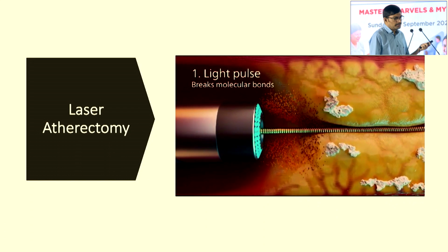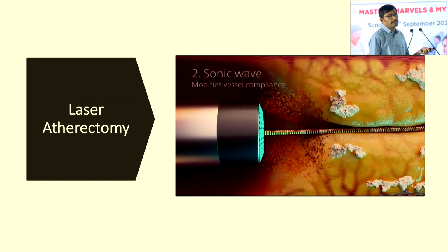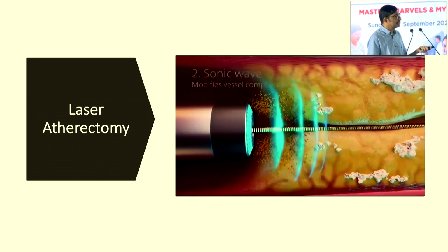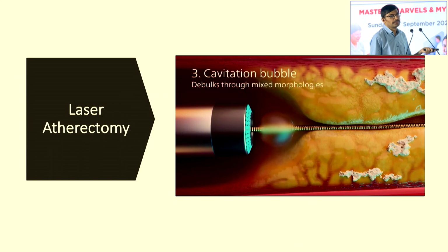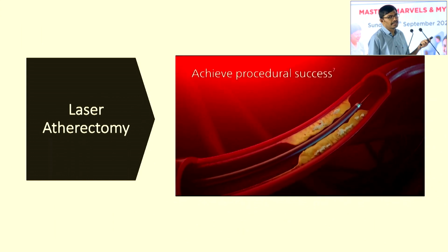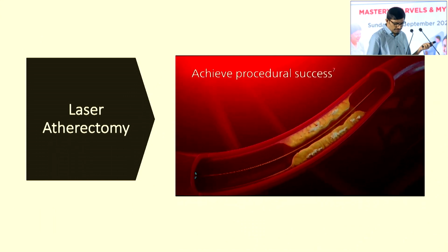So all these new technologies made our calcium treatment feasible, and most of the calcified lesions we can address safely and without compromising patients' safety, and improve the outcomes. Once you prepare these lesions with this type of technology, and patients get good stent areas, these things last longer, and patients will have a good outcome.